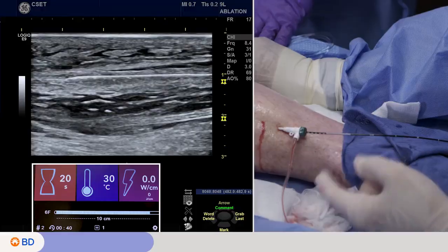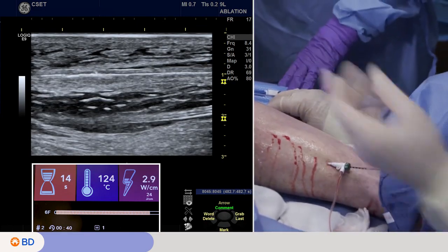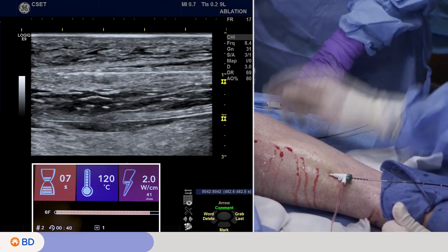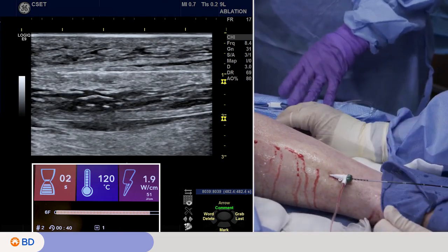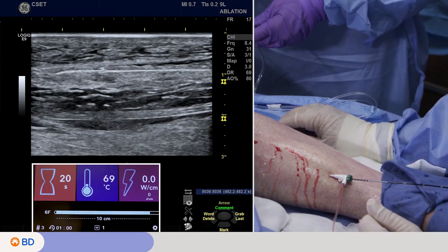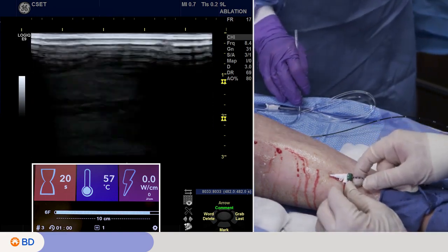It happened to work out perfectly that this is where the end of the sheath is a safety distance away from the beginning of the coil, so you're not heating the sheath. We also like to watch the ultrasound to show that we're seeing treatment effect. We see scintillating or bubbling, if you will, or boiling of the blood to know that we're delivering the heat energy. So several different ways of getting feedback that you're delivering the treatment.